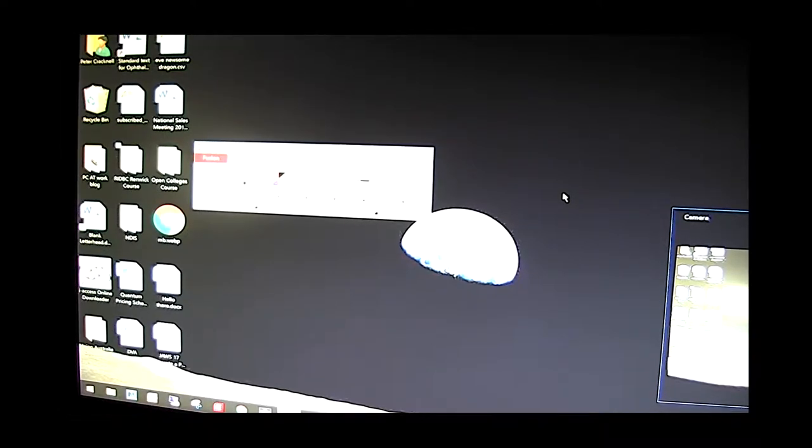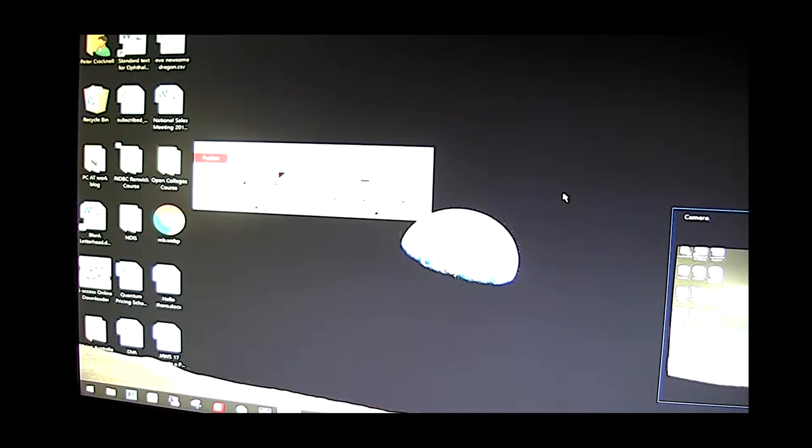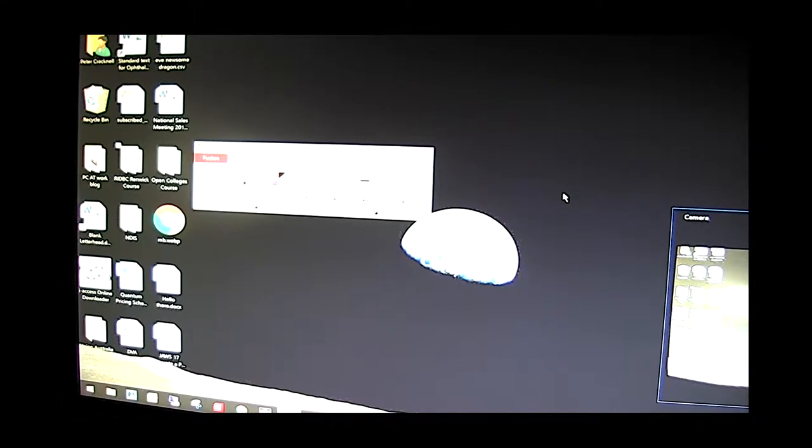So I'm just looking here at a computer screen unmagnified. I've got ZoomText Fusion running at the moment but with only one times magnification here.